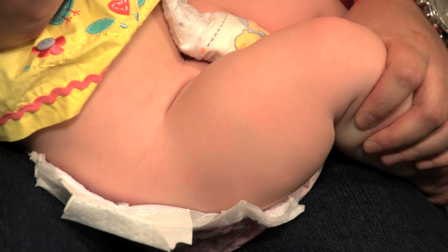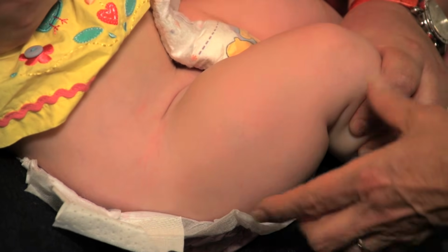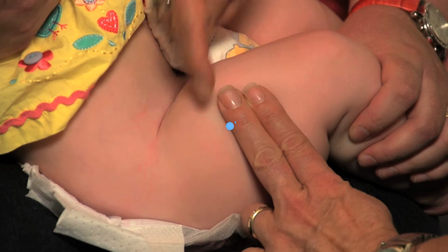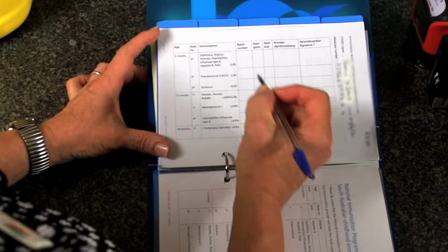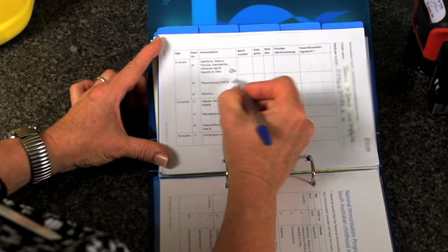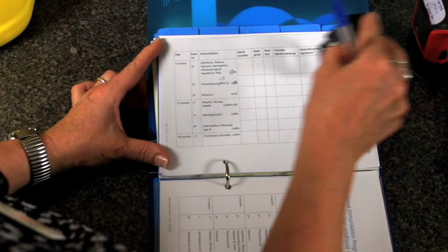When 3 or 4 intramuscular vaccines are to be given to an infant at the same visit, 2 injections can be administered into the same anterolateral thigh, as long as they are separated by at least 2.5 centimetres. Remember to record the location of each injection so that if the child does experience a local reaction, you would know which vaccine caused the reaction.